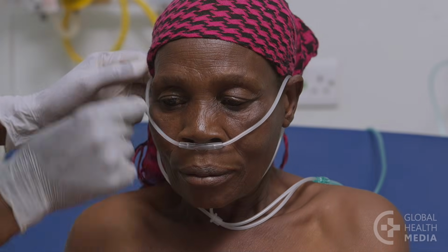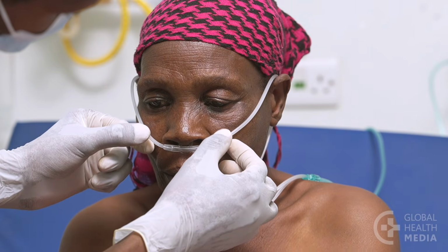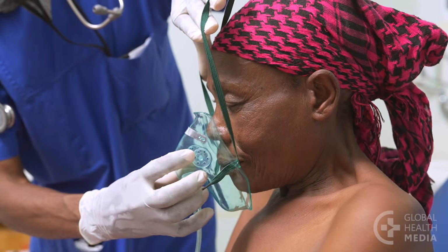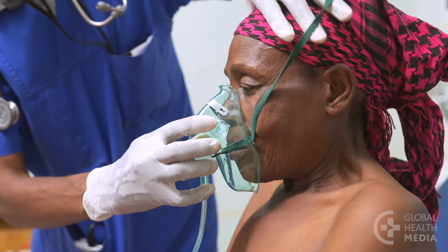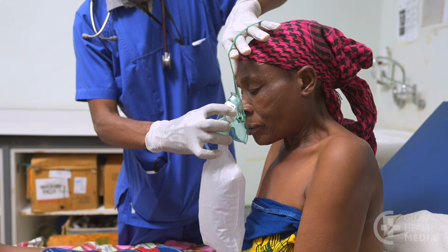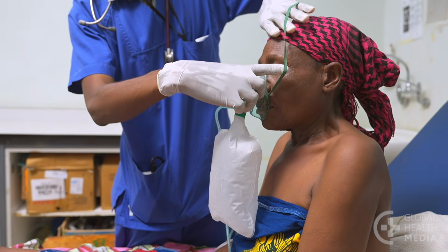Remember, escalate oxygen therapy from nasal cannula to simple face mask to non-rebreather mask according to the patient's response and oxygen needs.